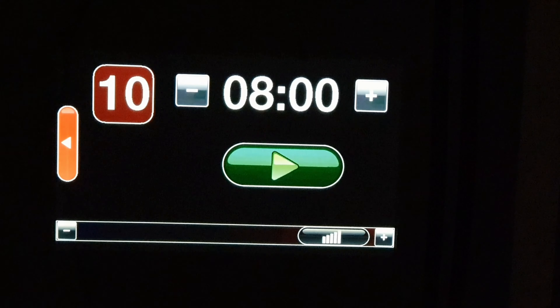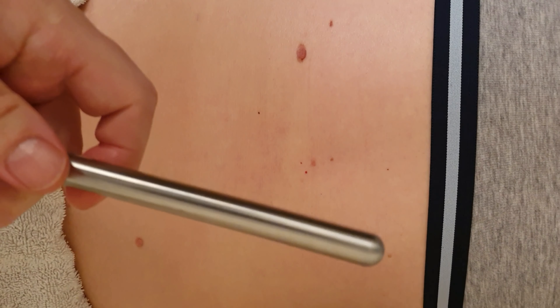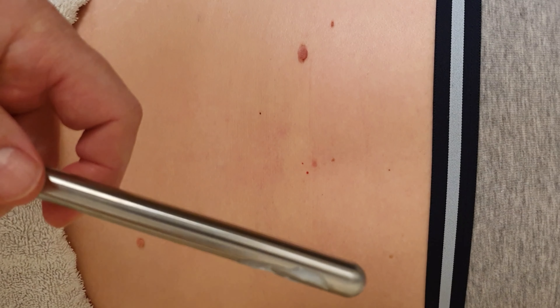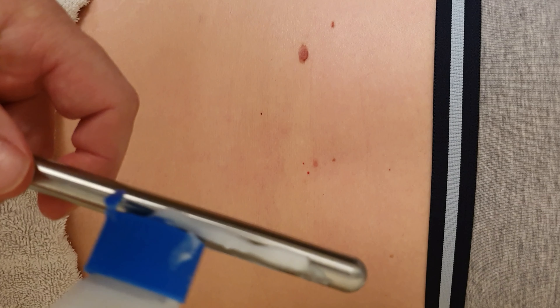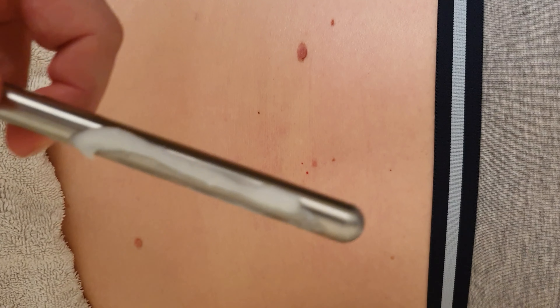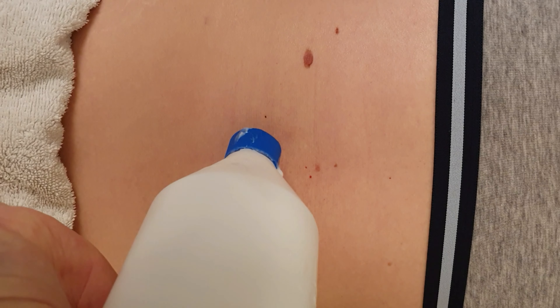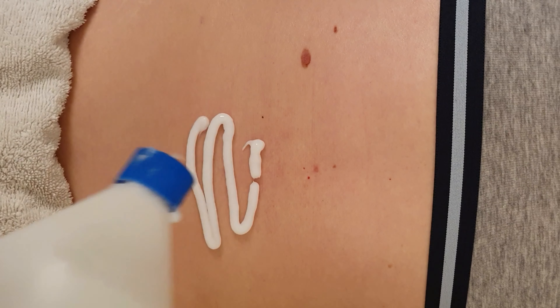When we get to the patient, we need to apply the earthing electrode. We'll put some contact medium on the earthing electrode and spread that contact medium out. Then I'll put the earthing electrode just underneath the patient here. As long as it gets into skin contact, it's perfectly fine. Once we've got the earthing electrode in place, we'll put some contact medium onto the area that we're interested in. In this case, we're going to be looking at the muscles on either side of the spine.